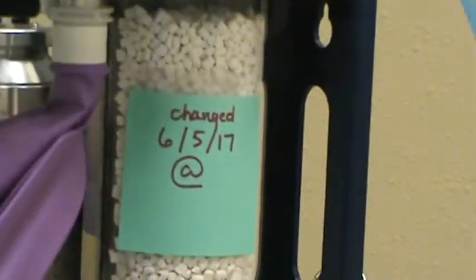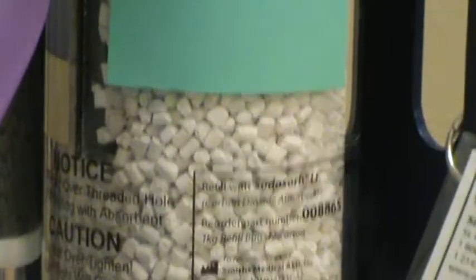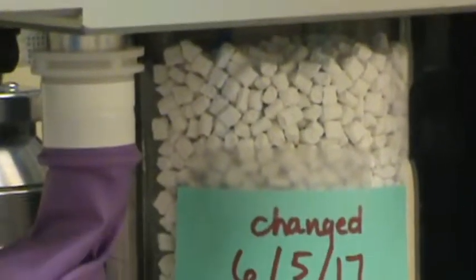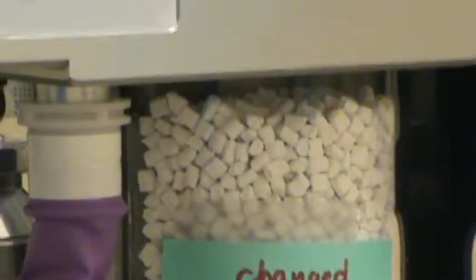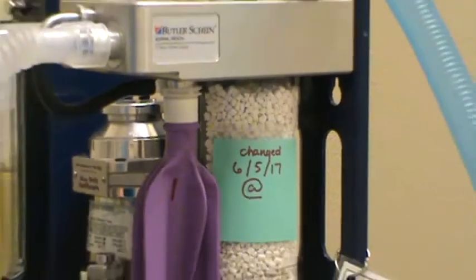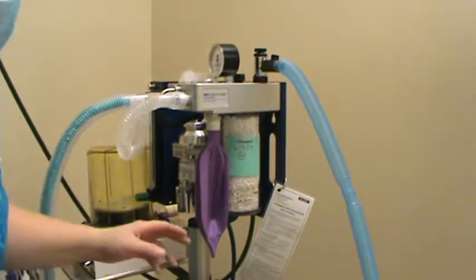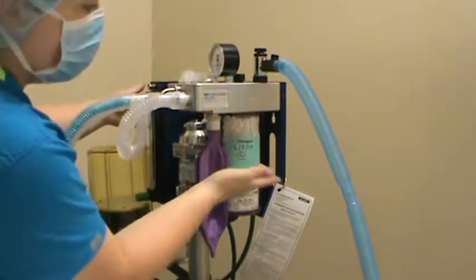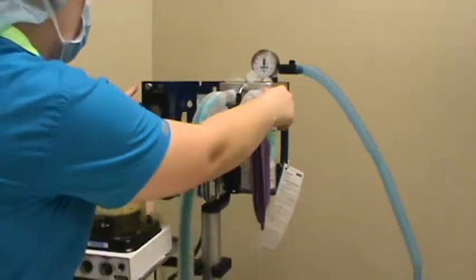It looks like our granules are nice and white. White granules are good and the date says it was changed yesterday. If they're purple or slightly turning purple they are expired, but these are white and they're not crumbly. So we're looking good.